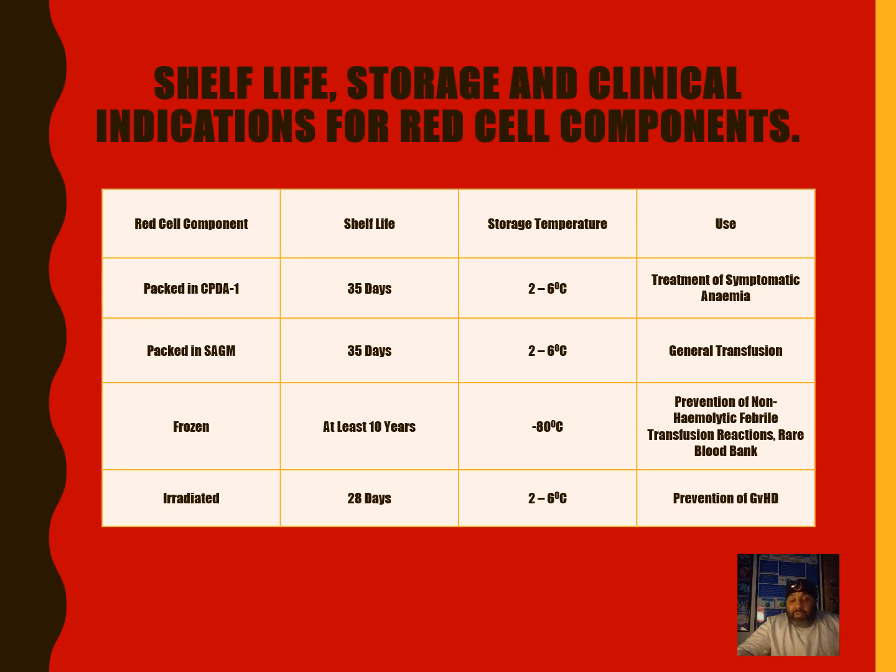And the use for frozen red cell components is for the prevention of non-hemolytic febrile transfusion reactions and rare blood bank conditions as well.